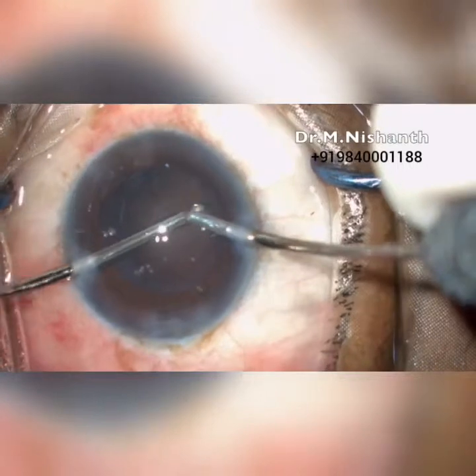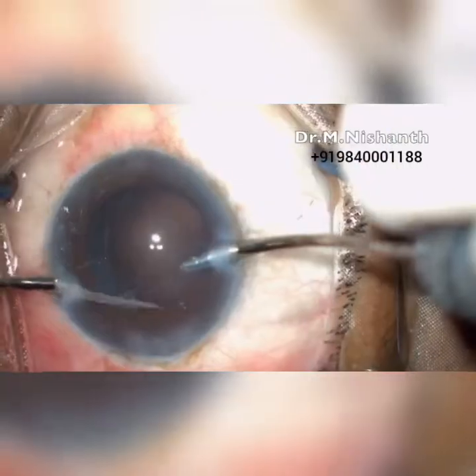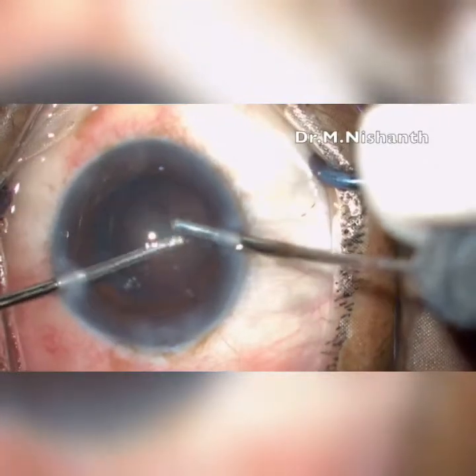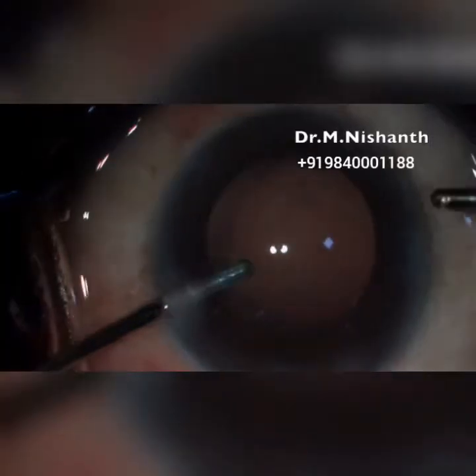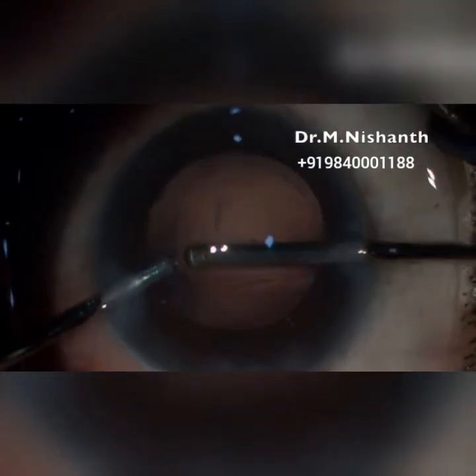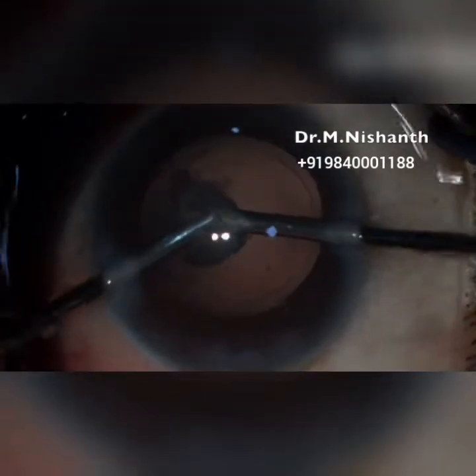Cortical cleanup is done with bimanual irrigation and aspiration. Always aspirate cortex in a clock-hour pattern, as you won't leave behind any remnant cortex and it will be easier to remove the whole of the cortex.